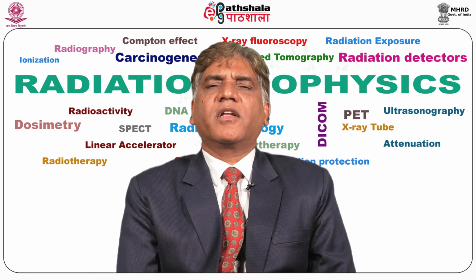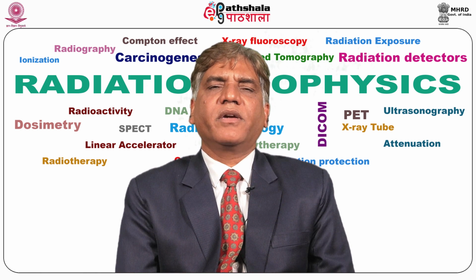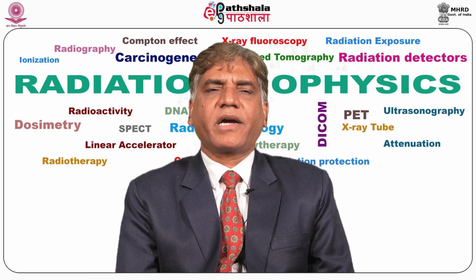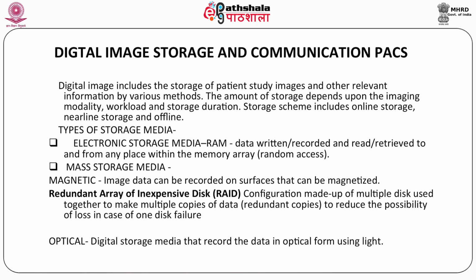Now coming to digital image storage and communication. We call it picture archiving and communication systems, PACS. Digital image storage includes the storage of patient study images and other relevant information by various methods. The amount of storage depends on imaging modality, workload and storage duration. The storage scheme includes online storage, near online storage and offline storage.